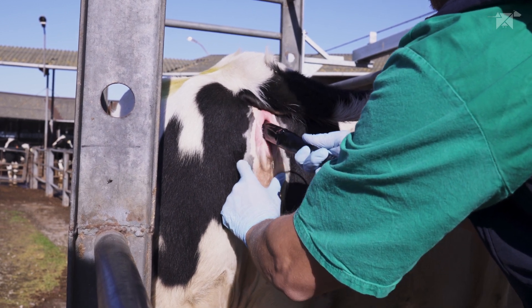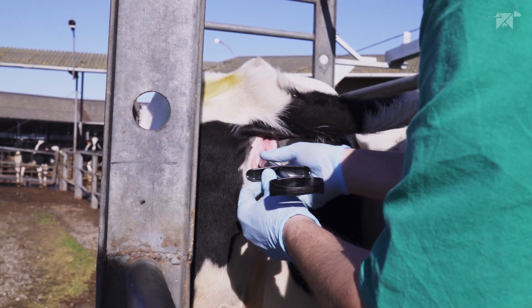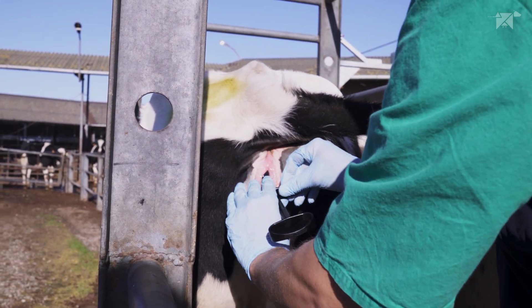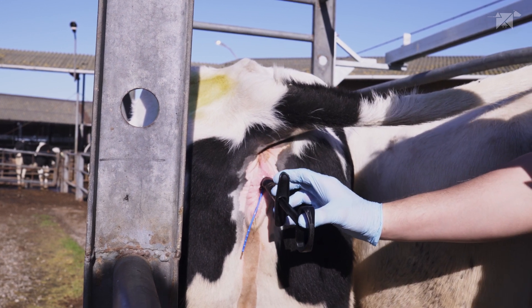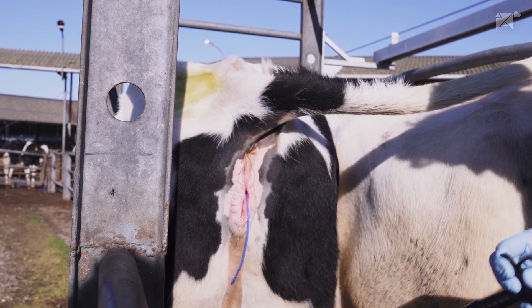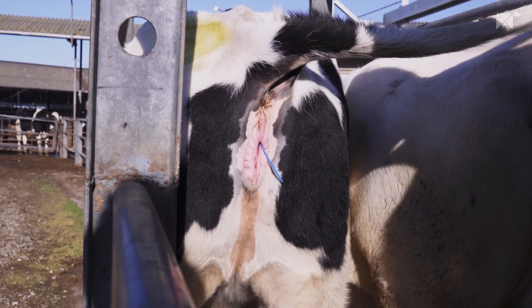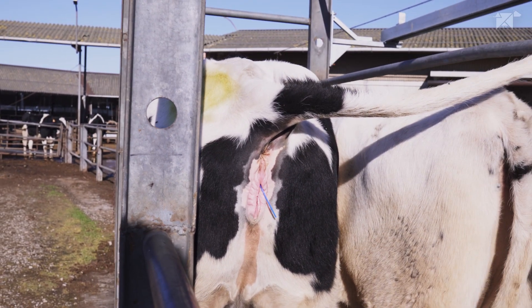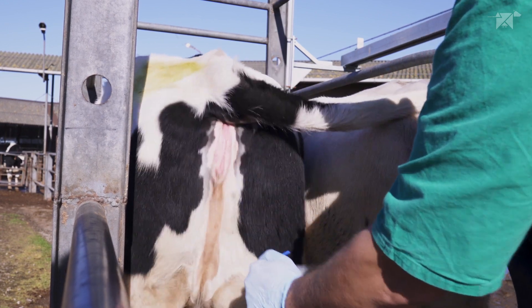When using Predelta in heifers, consider reducing the length of the device tail, particularly if heifers are housed collectively. Cut the tail of the device five to ten centimeters outside the vulva, ensuring to leave a sufficient length for easy removal of Predelta at the end of the treatment.